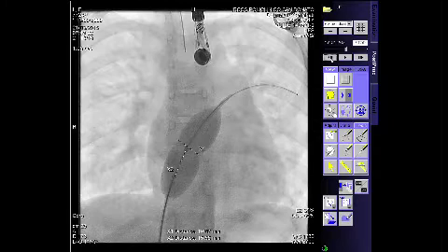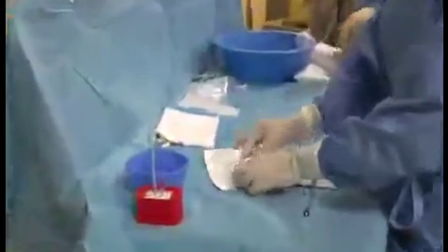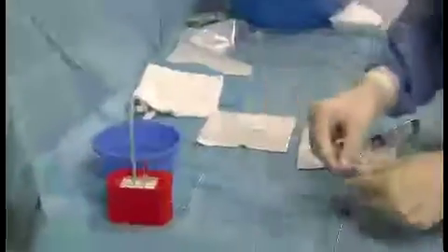Okay. Now Lucien and Luca will load the device. Can you go with the camera to the table? Lucien and Luca will load the device. Give us a nice view. While they are loading the device, are there additional questions or comments? So this is the regular implant.